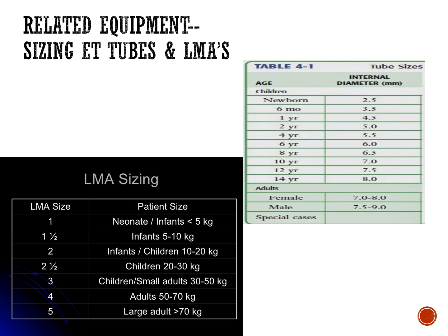Sizing endotracheal tubes and LMAs. So in the upper right-hand side, in that light green, we have listed the different size endotracheal tubes, age-specific. The bottom portion of that, in that solid green section: for a female, the range is typically 7.0 to 8.0, and for a male, 7.5 to 9.0. And again, just something to consider when you're sizing them.